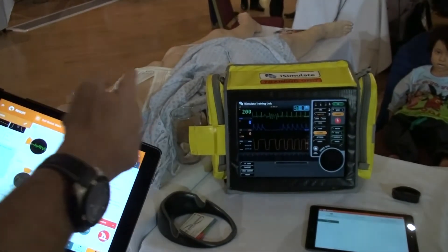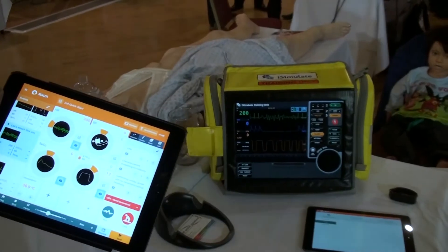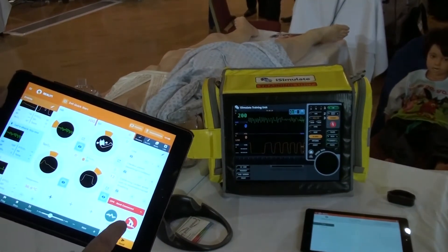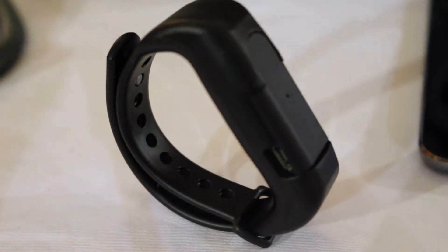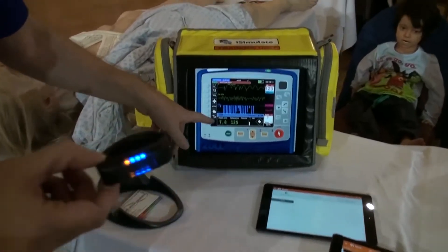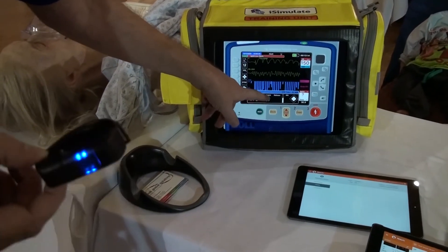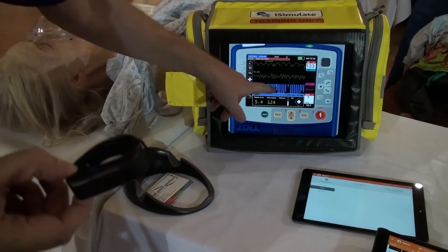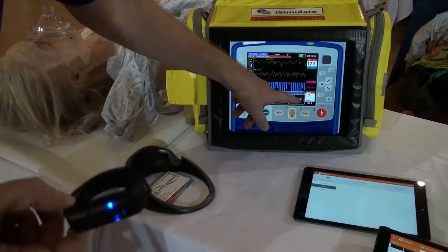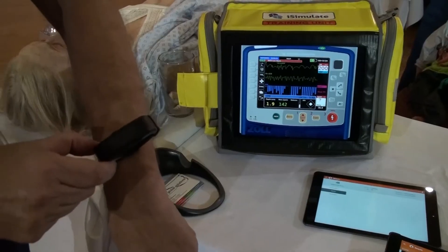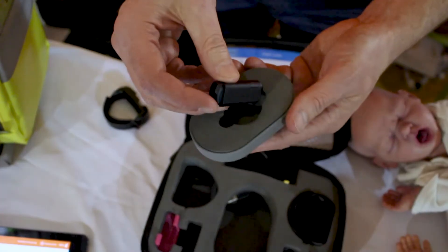You'll see that the traces will drop out in line with what you would expect. So if you're doing CPR, we've got this CPR wristband. By doing the CPR, I'm getting my depth of compression, my rate of compression, my recoil, and my perfusion index. You can wear this around your wrist or mount it inside the mannequin.